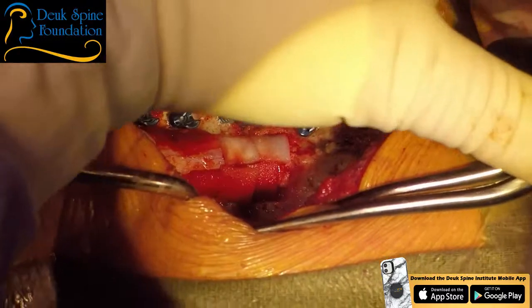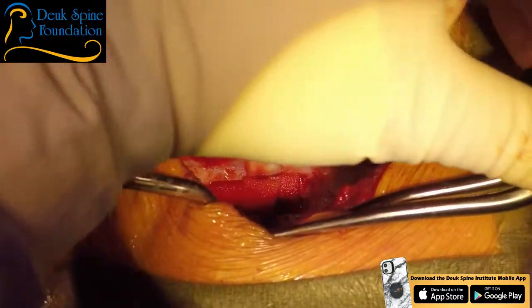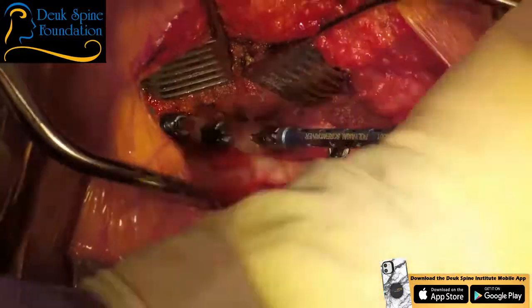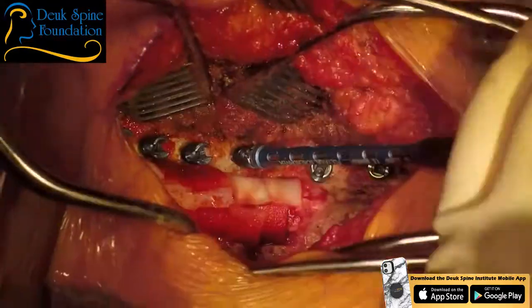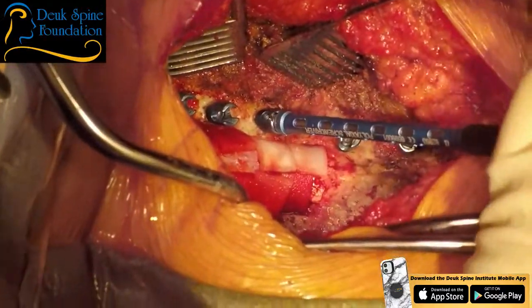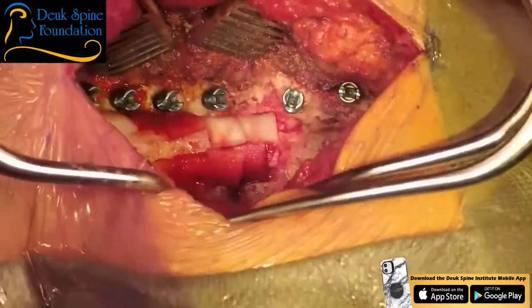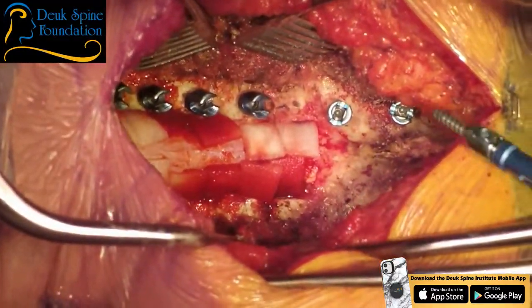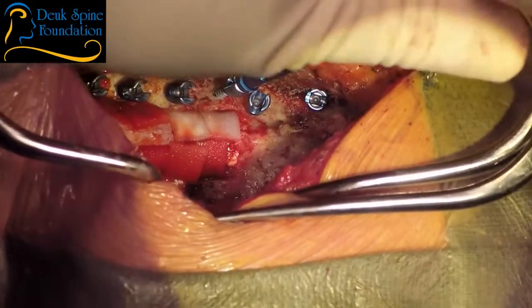Yeah, the hardware won't last forever. These screws and rods will fail eventually. They're just not designed biomechanically to survive the lifetime of a patient. They're designed really to survive long enough to let the body fuse the bone. Let me see. That may be okay. I may have to seat it a little more.